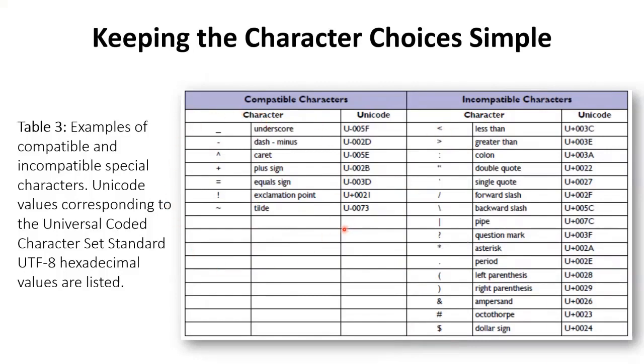In other systems, it's allowed. Like, let's say in Eclipse, you can use the AND. It's allowed. But in other systems, you cannot use it. In some systems, you cannot use the dot. You have to write the name dot, D-O-T, instead of the dot symbol, if you would like to use the dot symbol in your naming prescription.